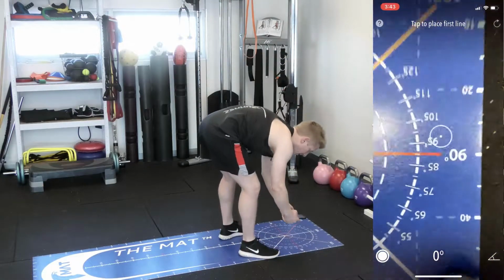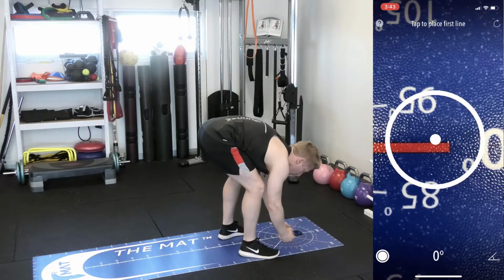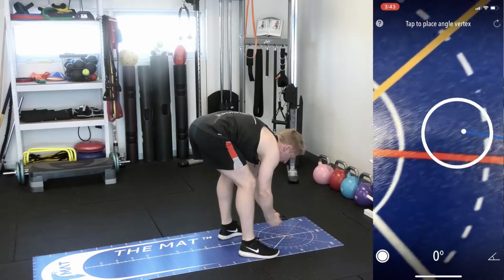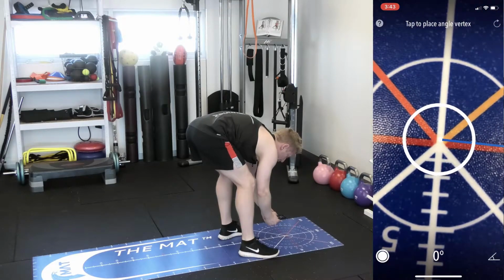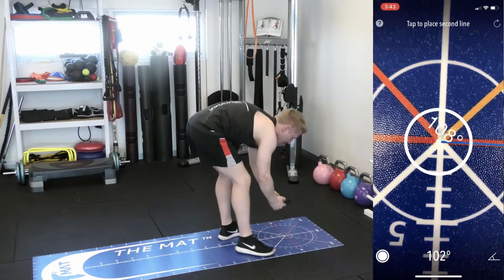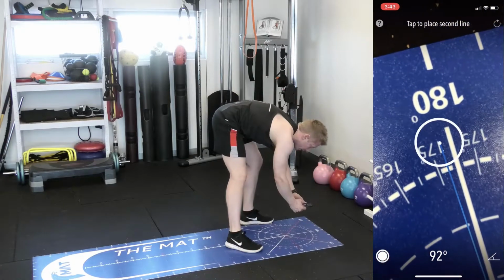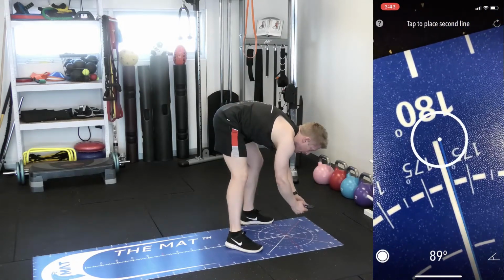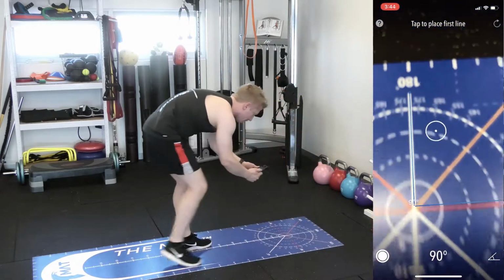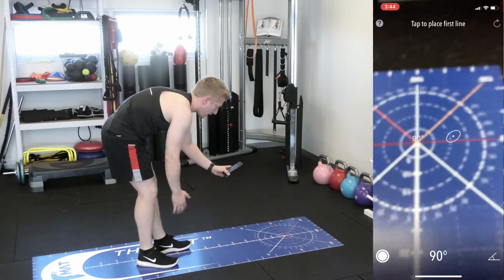So I'm going to measure from the start measurement line, this red line here, and I'm just going to tap the screen and put a start point on there in an accurate spot. I'm then going to track along to the center of the mat, right in the middle there, and then I'm going to tap again for the screen to reset, excuse my angle there, and then I'm going to follow along this 180-degree line on the mat, okay? And again, I'm going to put that measurement down. What I'll do is I'll step away, and we'll see that we'll get a measurement.